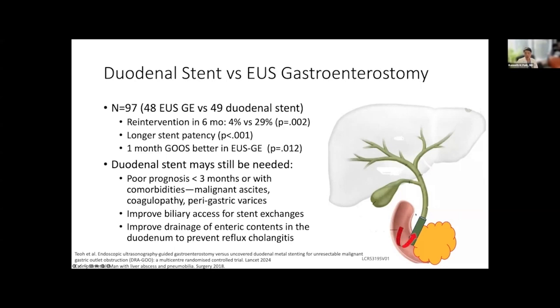Well, it's because you have a closed outlet here, and despite this patient having another route for food to get through, some of it through the gastroenterostomy that you created, some of the food will go into the pylorus and start accumulating here, and all that food will reflux up into the biliary tree, basically creating a cesspool.